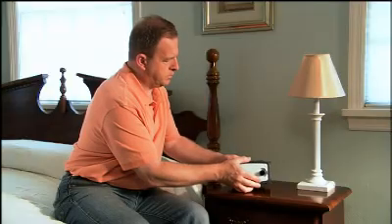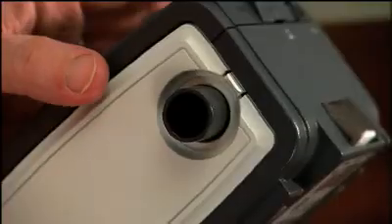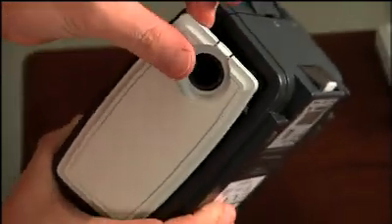Since breathing forced air can dry out your nose and mouth, your doctor may prescribe a humidifier to add moisture to the air you breathe. To connect a humidifier to a System 1 device, remove the side cover. Press on the tab behind the air outlet port and gently pull the cover off.